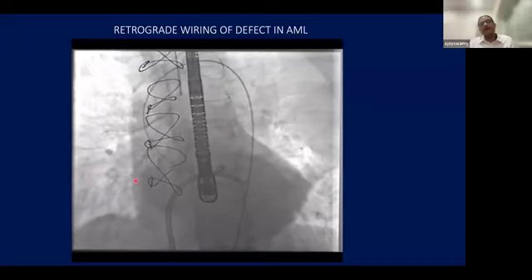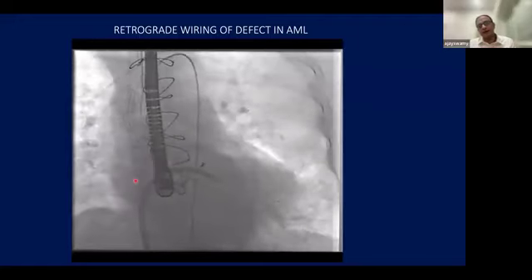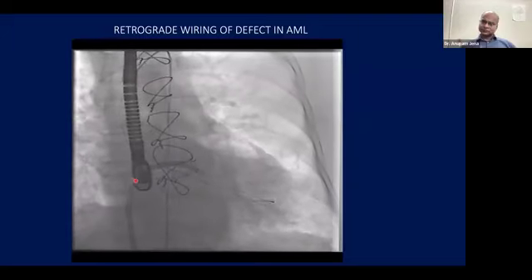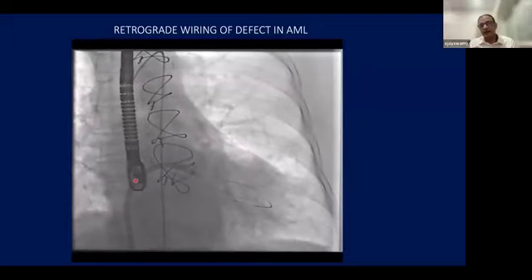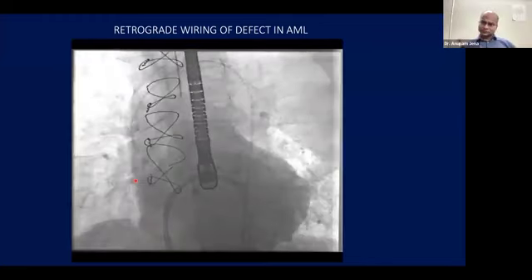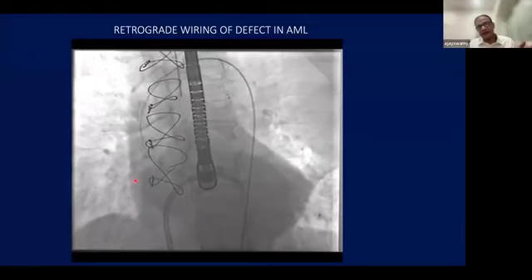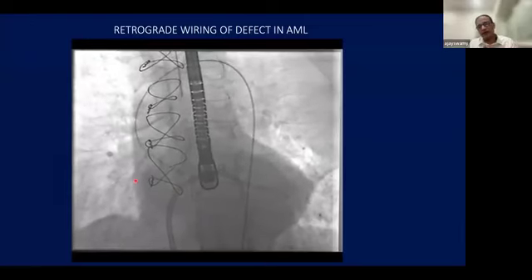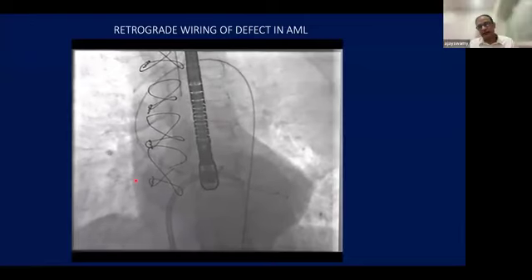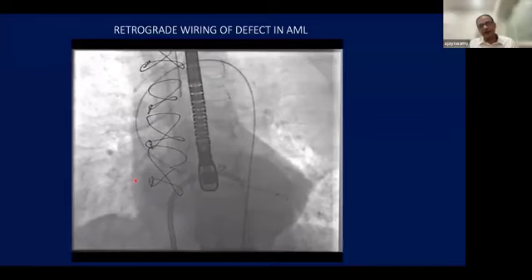So then that also is important to judge. The Konar is a much softer device. If it is smaller, then you can even use the ADO2 because it is more flimsy and more easily deliverable. The ASD actually limits the movement of the leaflet so much that unless one side is against the wall of the annulus, if it is actually in the leaflet which gets perforated and not holding on to one side of the annulus, then it becomes very difficult for it to close.